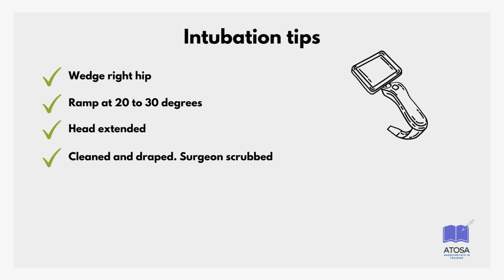For these reasons, I suggest a hybrid method be adopted, where the surgical team is scrubbed prior to induction, but the cleaning and draping of the patient only proceeds after successful endotracheal intubation is confirmed. Of course, in extremely time-sensitive scenarios like cord prolapse or a severe fetal bradycardia, all of this will be happening simultaneously. Finally, I check that suction is on and working.